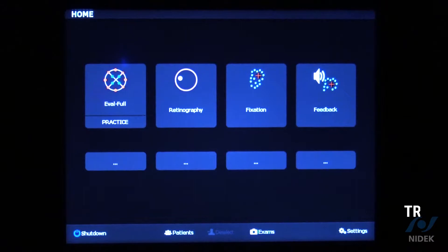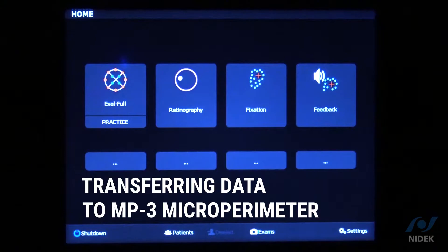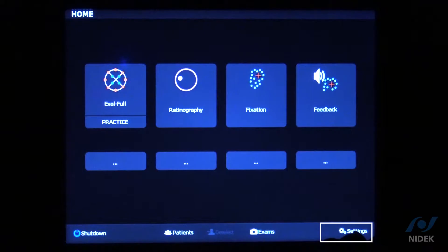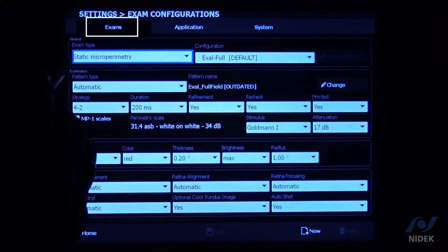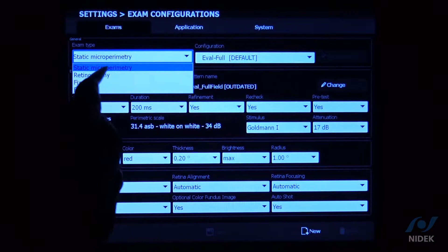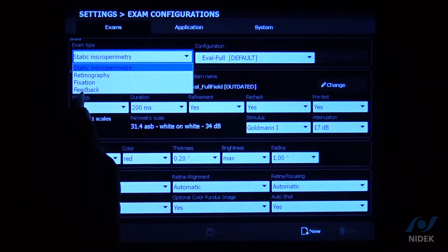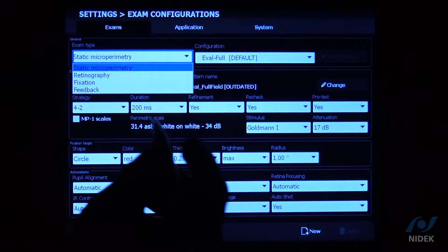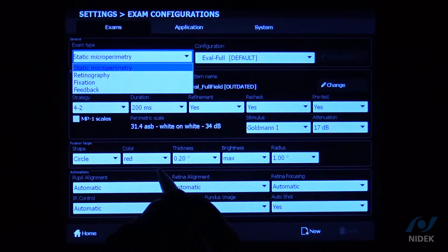Now I'm going to show you how to transfer the demo pattern I customized into our Navis EX software. To do that, go into the Settings tab on the bottom right-hand corner, then go into Exams and select Static Microperimetry. On the drop-down box we have static microperimetry settings, retinography settings, fixation settings, and feedback settings. This is where you'll change your default settings for each exam you're going to transfer from Navis EX into the main body of the microperimeter.